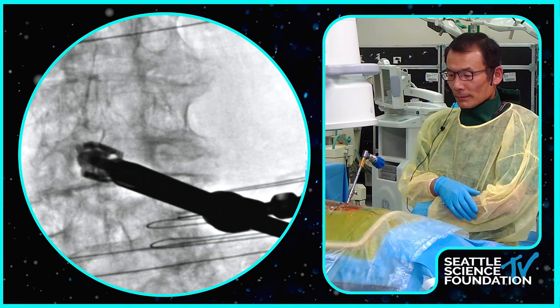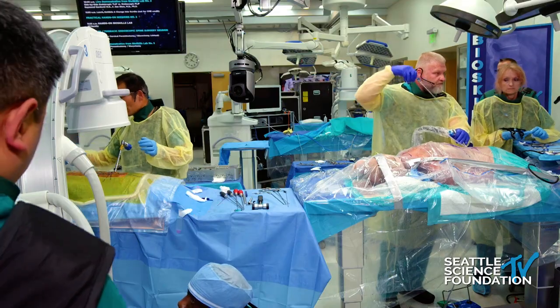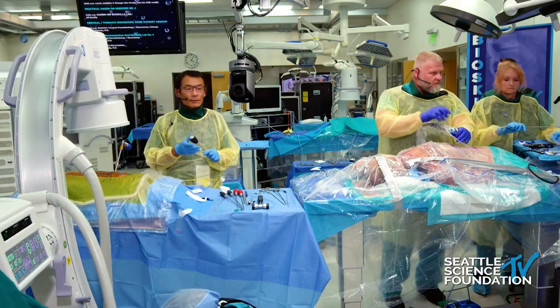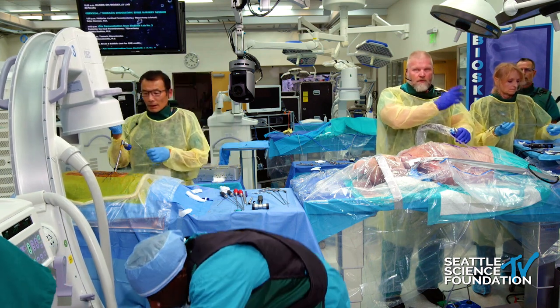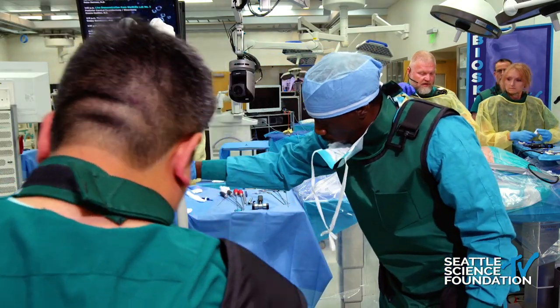Okay, that's good. So Ray, are you ready? Yeah. All right, let's go to Ray and show. Let's collapse it. Yeah. Thank you. Another grasper back. Come on over with the X-ray, so we confirm that we are where we think we are.